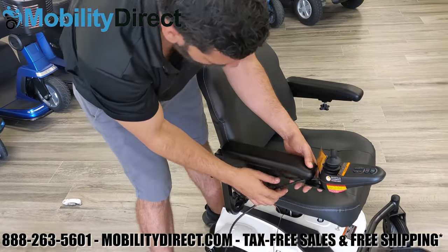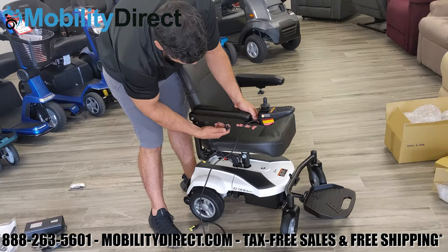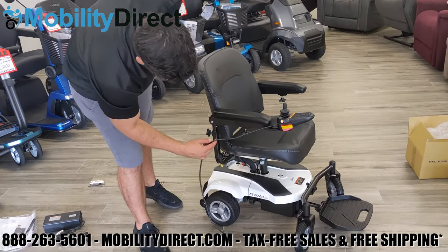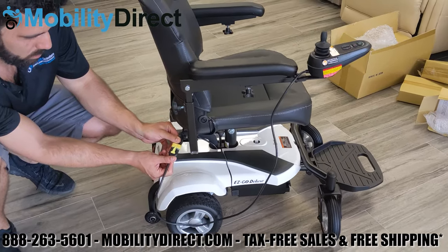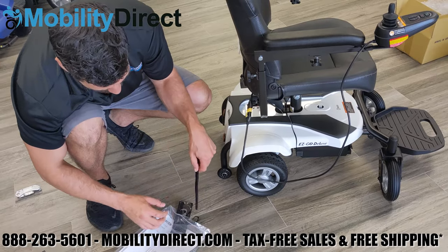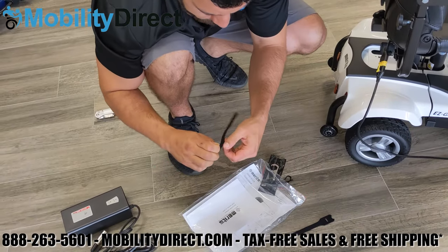At this point, go ahead and secure the cable, then plug in the harness from the joystick cable into the receiving harness that comes out of the base. Here we're separating each of the Velcro straps that are used to secure the cable to the armrest rails.